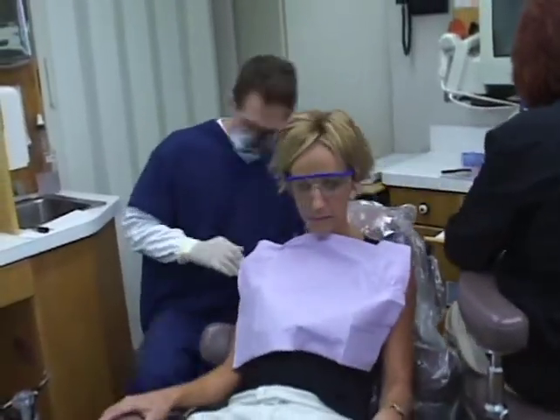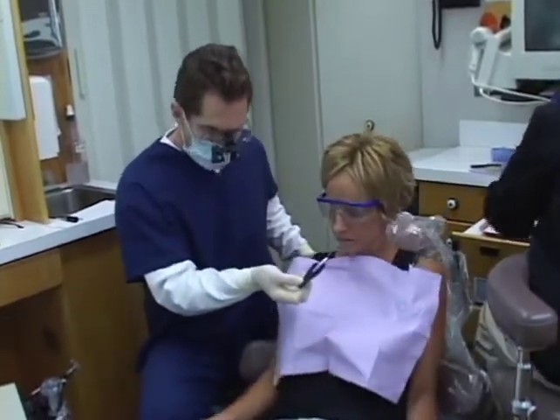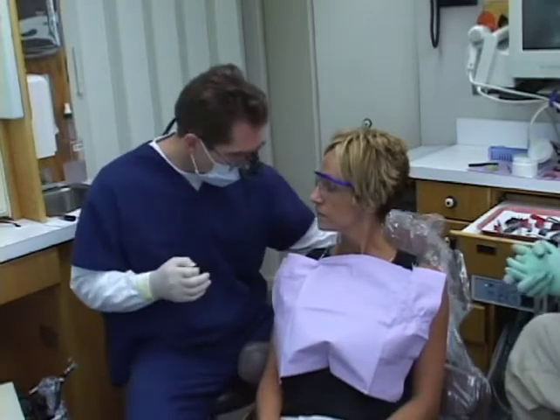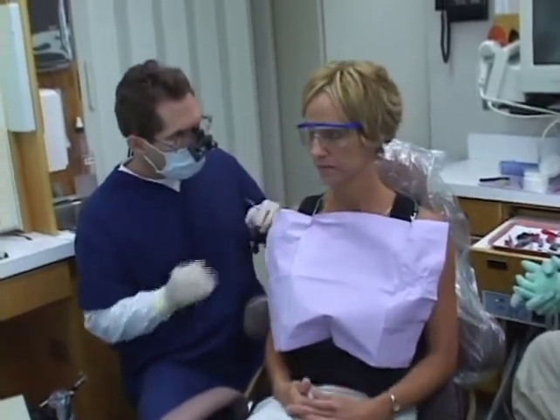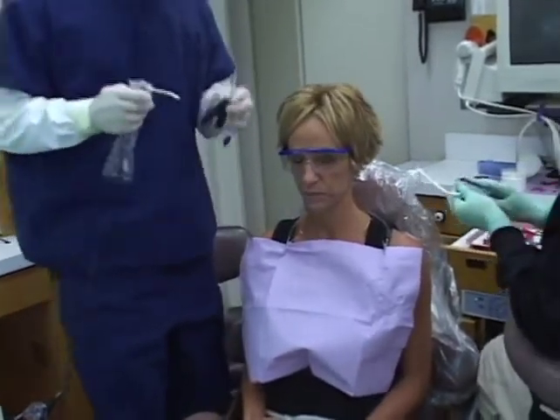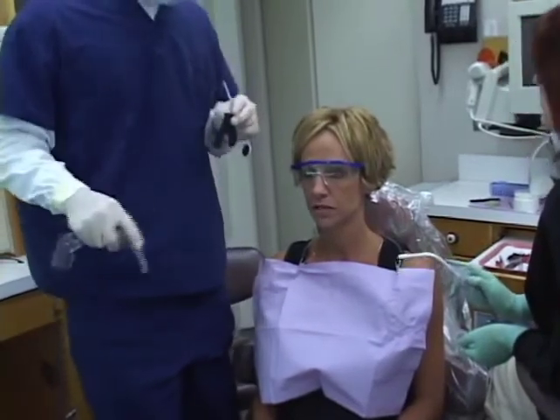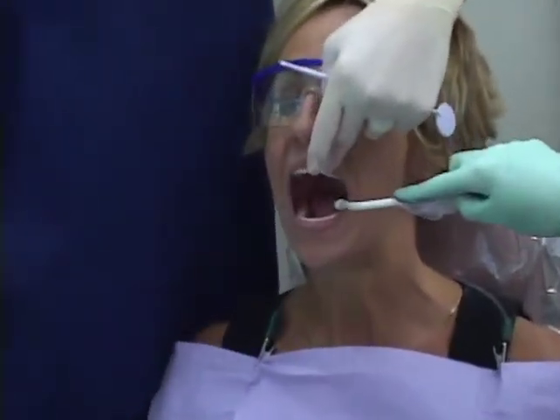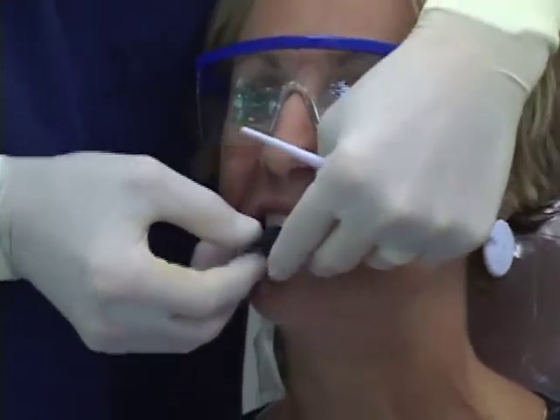We're comfortable with anterior guidance as being protective of the posterior teeth. Now we want to see if that anterior guidance is in the way of the envelope of function. I'm going to have you sit up, Debbie. We use this very heavy horseshoe paper. Just pretend like you had an old piece of chewing gum back there and you were chewing your back teeth. We're expecting to see marks on the canine, but not on the anterior teeth - that would indicate envelope of functioning interferences. We don't want any contact of teeth 7 through 10 in function.